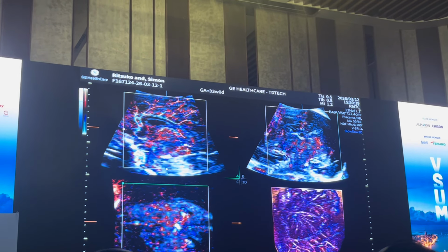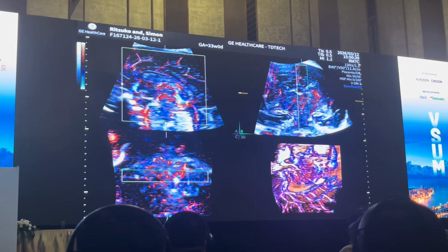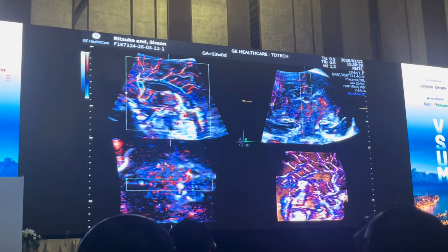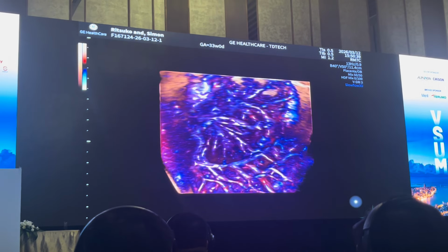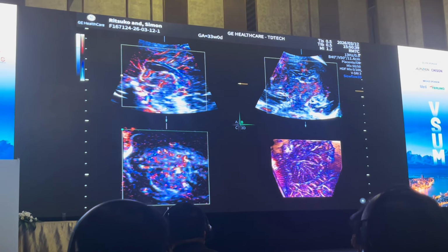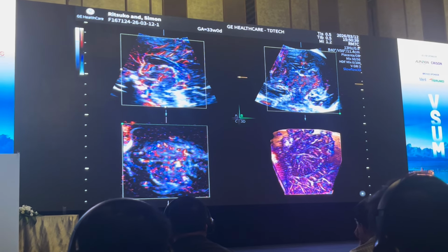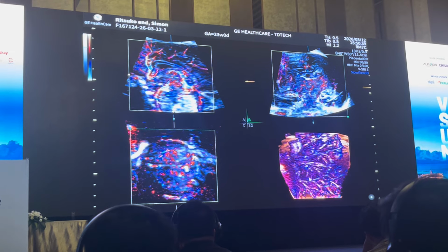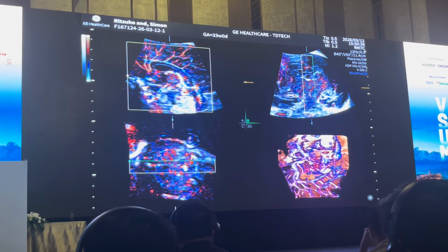Here it is quite difficult to see, and then I reduce the volume like this, and then it is quite clear to see. Here you can see, right? If you are originally like this, it is quite difficult to understand what is what. However, what I said is to only look at the B plane here, adjust it, and then we use the volume like this. Beautiful. Then you can see it completely.